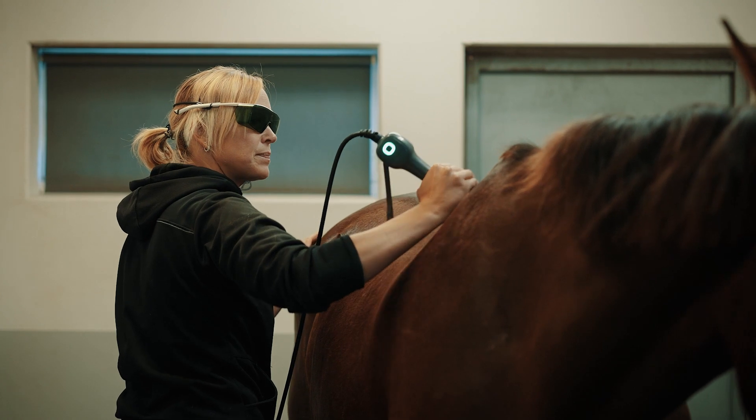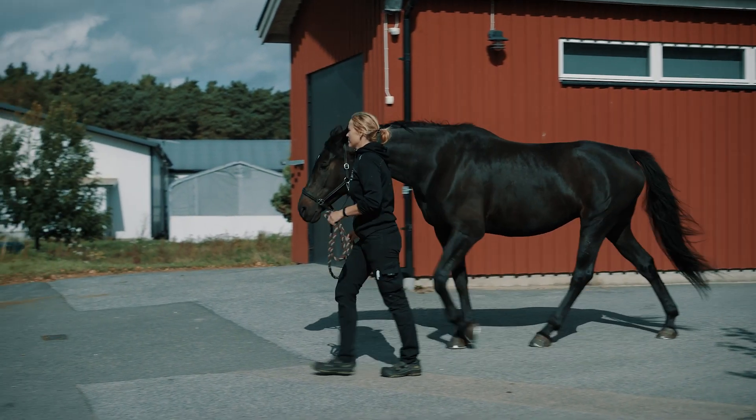We also use it on horses that have a stiff back and neck — we've seen some great results. I feel that the laser before the massage gets the horse to relax, making it easier for me to massage the horse. We also use it on wounds with fantastic results.